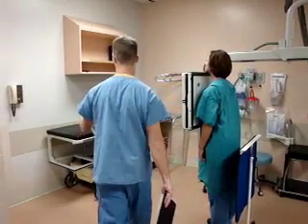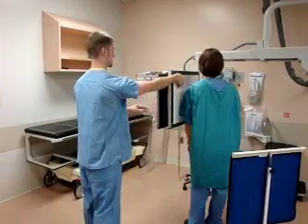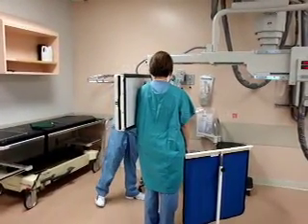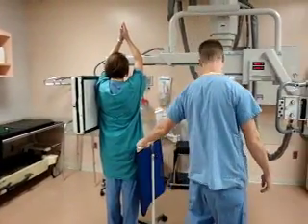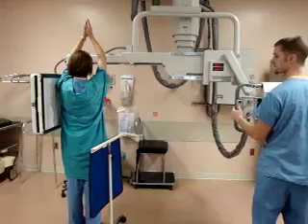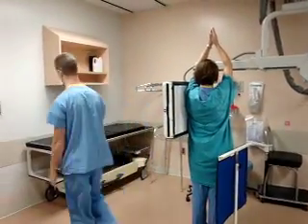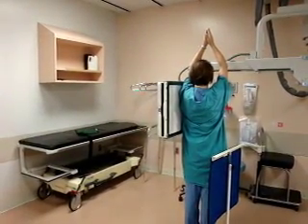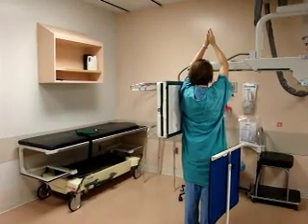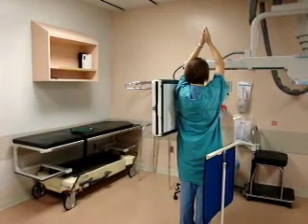For the second view, we have the patient turn so that their left side is against the board and have them raise their arms above their head. We make sure that they are centered again, have them take in another deep breath and hold it, and then take the exposure. And that is how a chest x-ray is done.